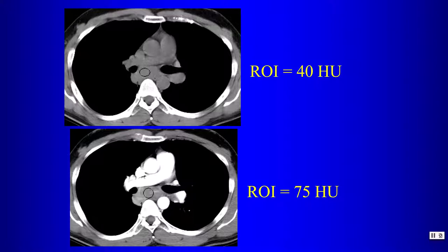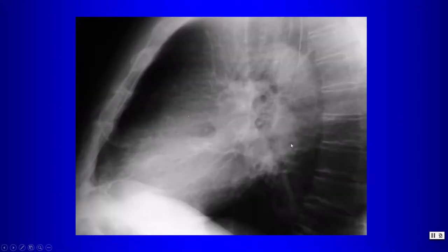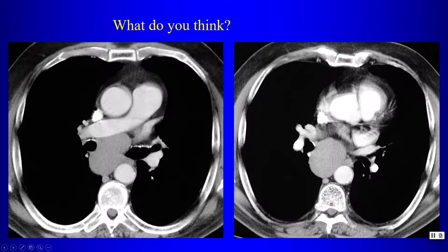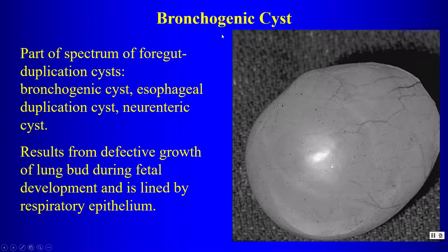Even in the typical location for a bronchogenic cyst, it is important to perform non-contrast and post-contrast imaging to check for enhancement and differentiate a cyst from a solid mass. Here is another subcarinal lesion — well-circumscribed on chest radiograph, and on CT it is higher in attenuation than simple fluid. However, on non-contrast imaging it is dense, and post-contrast there is truly no enhancement: this is a bronchogenic cyst.